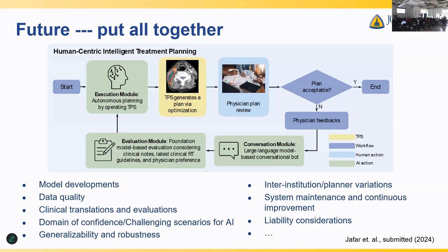Very interesting work, particularly the second part about using reinforcement learning for the planning. My understanding is that the action is the parameters, right? And the state is the new plan, and the reward is the mismatch between the previous and the new, right? That's right, yes. Okay. Have you tried to use a new reasoning model to replace reinforcement learning? No, we have been focusing on reinforcement learning over the years, yeah.